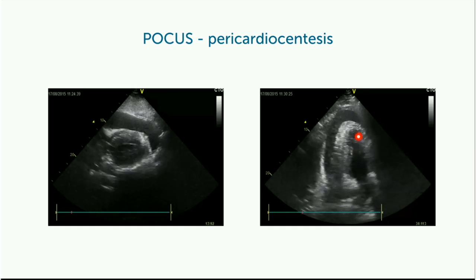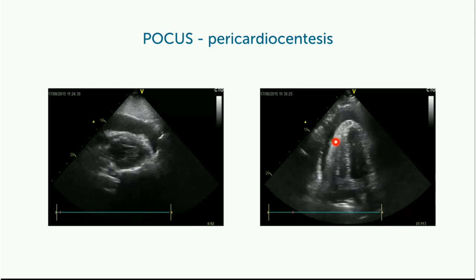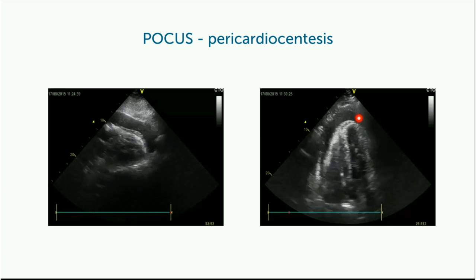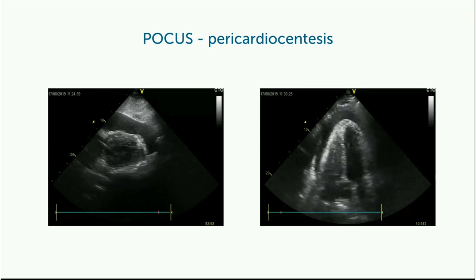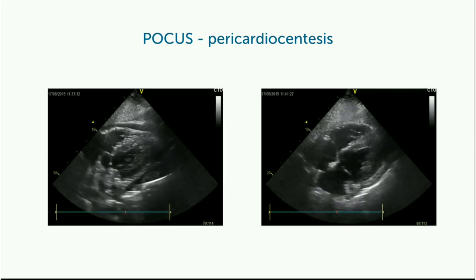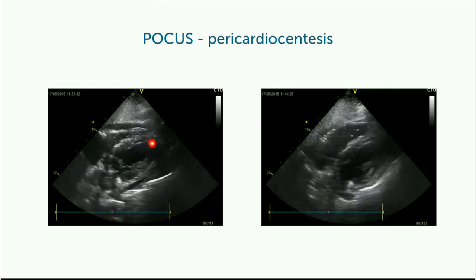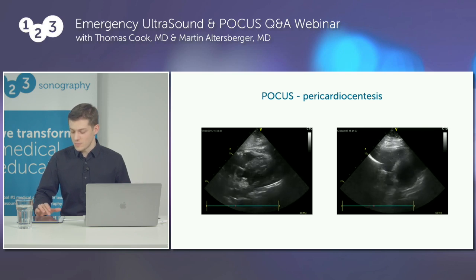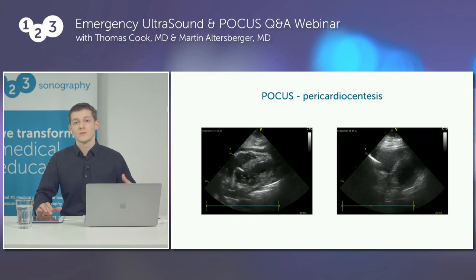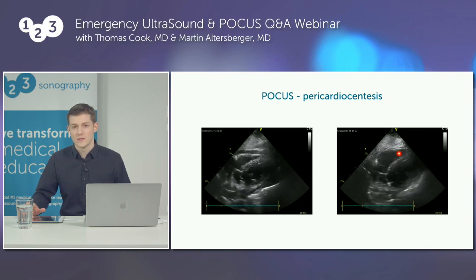And that you can already see here in this 4-chamber view. There is again this black area over here, and here you see something entering the pericardial sac. So there you already see that fluid is drained. If you take a look at 2 more loops of this patient, you see again in the center the heart, the left heart, the right heart, and here the right ventricle already is expanding. So this patient already profits from the intervention. And just a few minutes later, if you look at the time code over here, there is actually not very much free fluid to be seen.